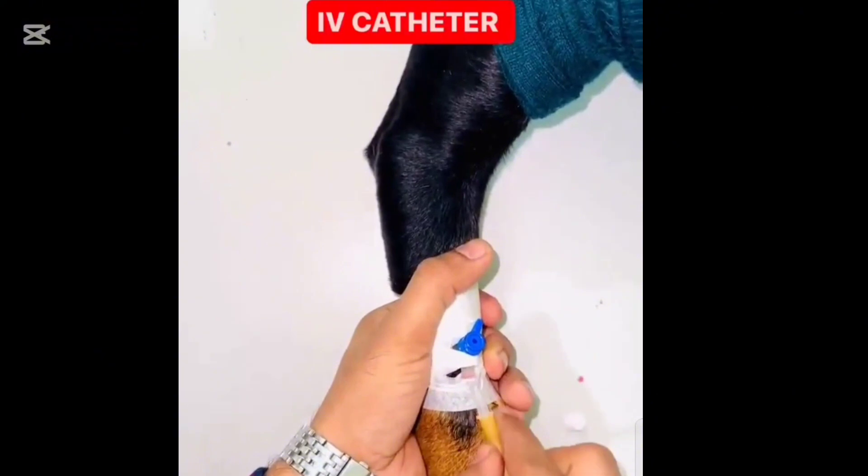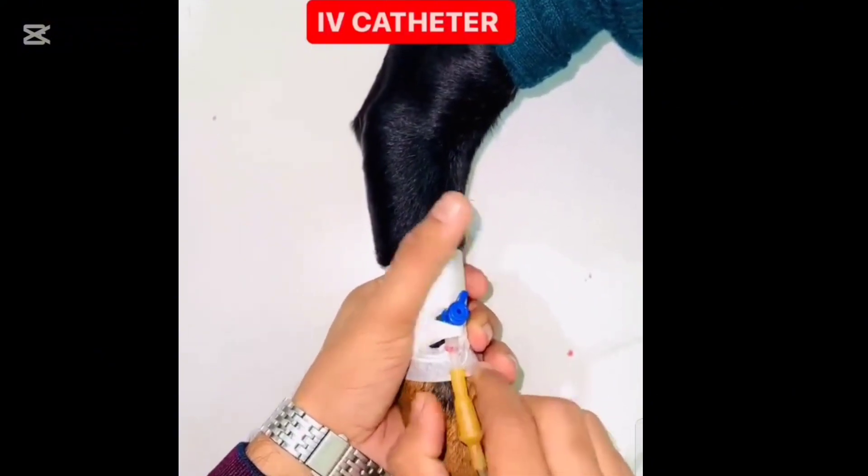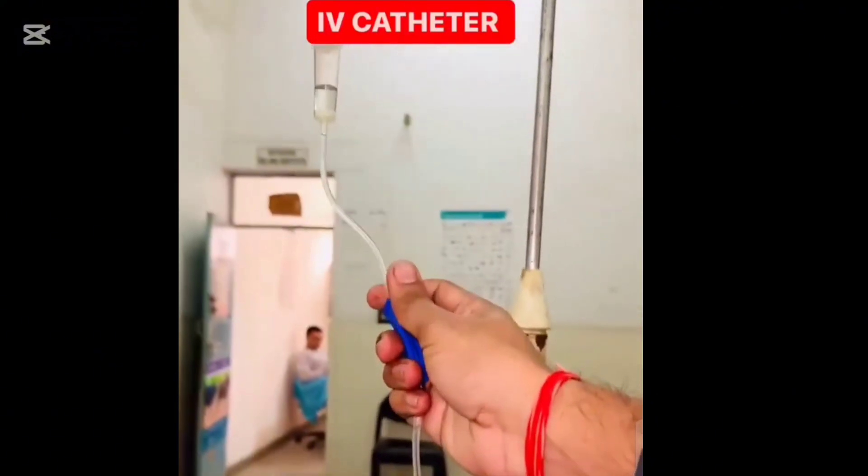Finally, flush the catheter with saline to ensure it's patent and functioning properly. Check for any signs of swelling or leakage.